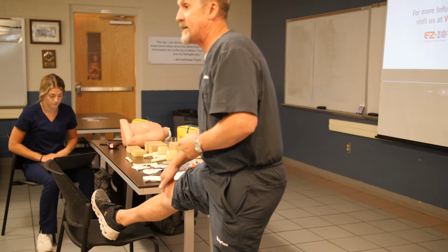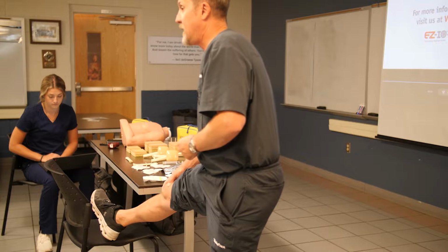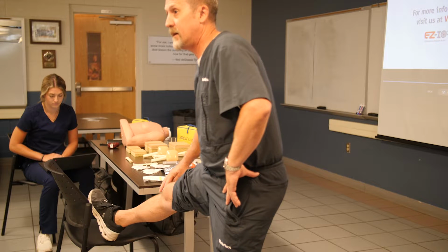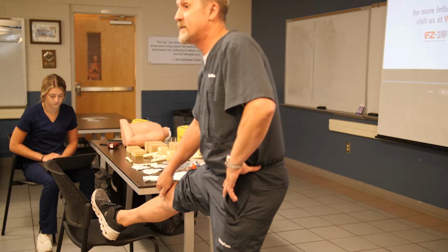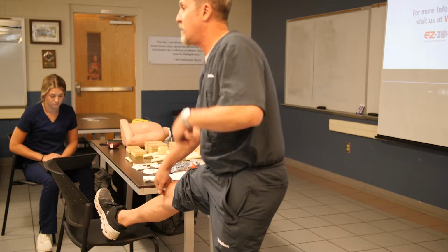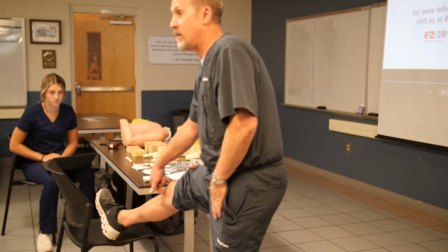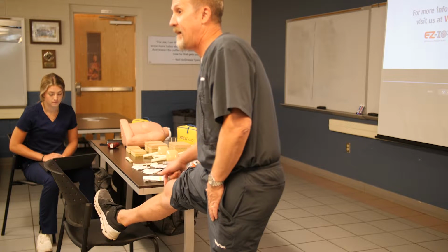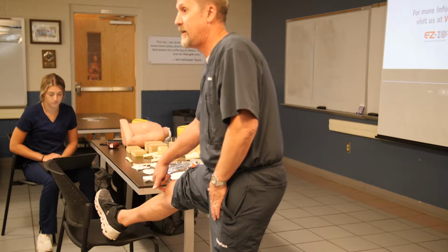On your pediatrics, that tuberosity hasn't fully formed oftentimes. So we're going to use the patella. And on your adult patients, you're going to go to the most distal aspect of your patella, and you're going to go about 1 to 2 centimeters distal and about 1 centimeter medial. Remember, we always go IO, big toe. We're going to go on the medial side. So we're going to go right into the area right here. Okay? On your pediatric patients, it's going to be about 1 to 1.5 and about 1 over, just because they're smaller anatomy size. Does that make sense to everybody?